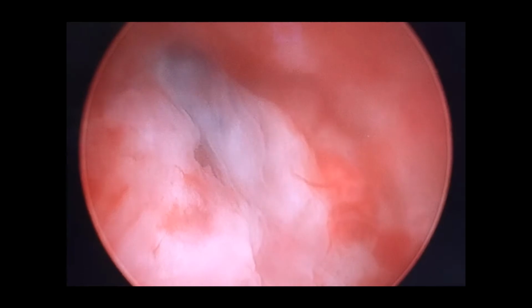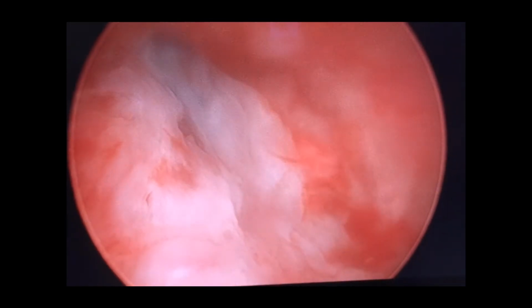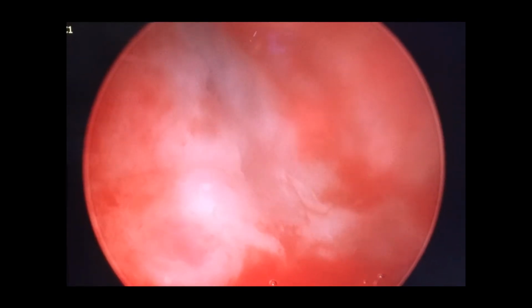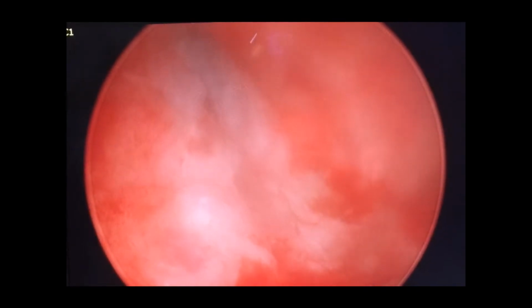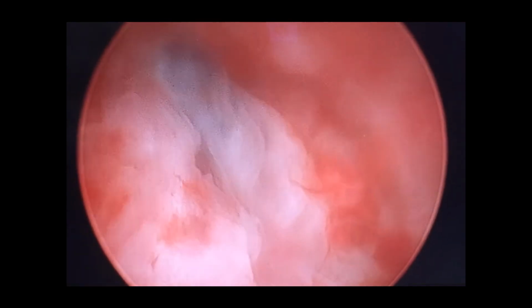Any uterine procedure, including hysteroscopy, carries risk of inadvertent vascular injury or bleeding. The potential for significant hemorrhage is increased when a high-flow vascular system is identified in the uterine cavity. However, when there is concern for retained products of conception, hysteroscopy may be a more appropriate next step, as this can be both diagnostic and therapeutic.